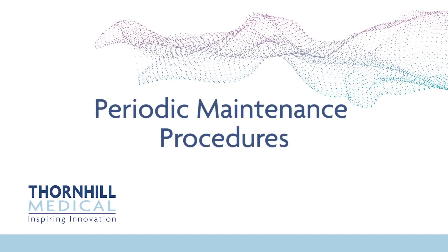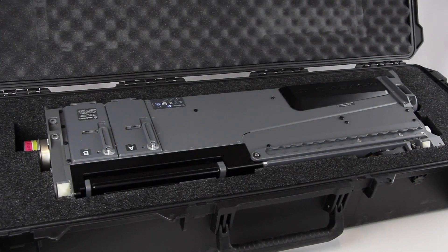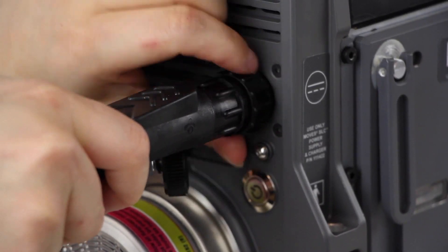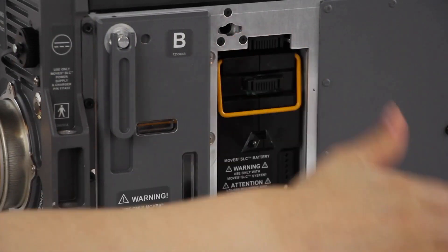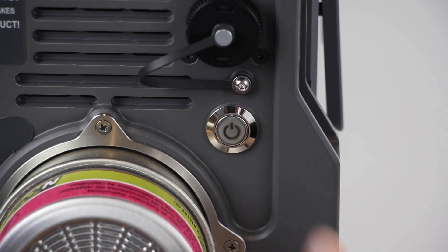Periodic Maintenance Procedures. Begin quarterly preventative maintenance by completing a system diagnostic. This can be done without the use of consumables for the purpose of maintenance only. Connect MOVES SLC to wall power using the power supply, then install both batteries into the battery bays of the device. Turn MOVES SLC on by pressing the power button at the rear of the device.